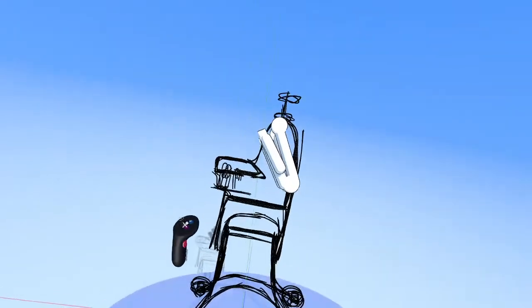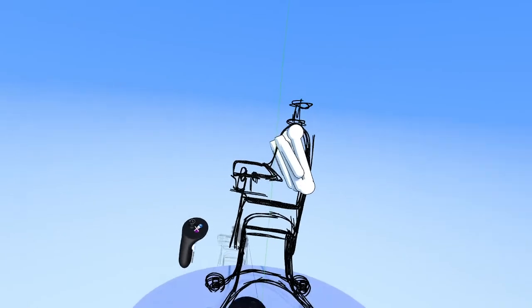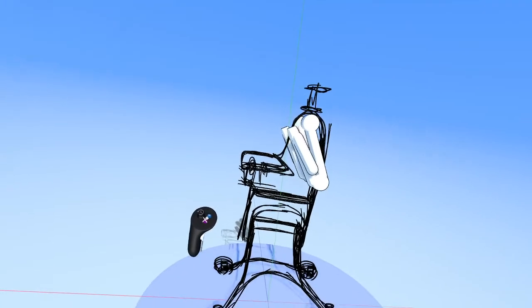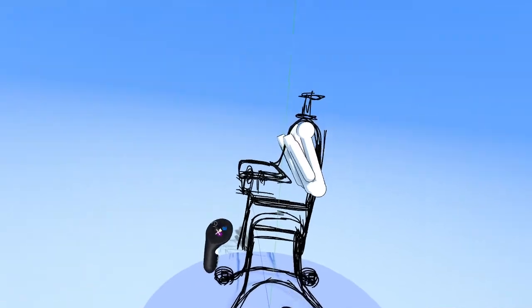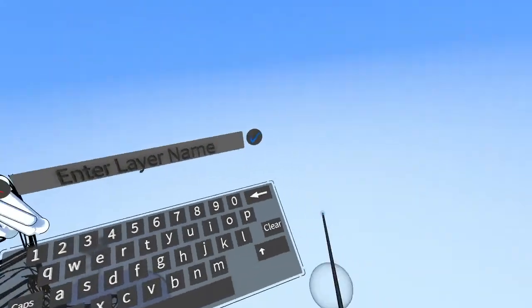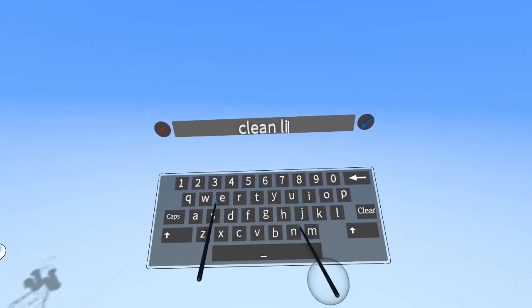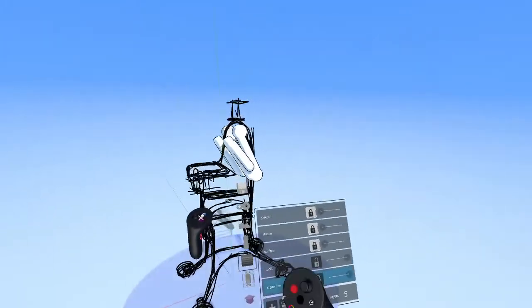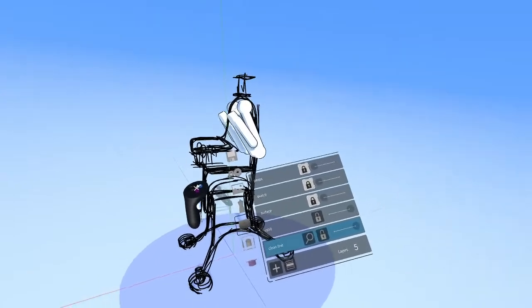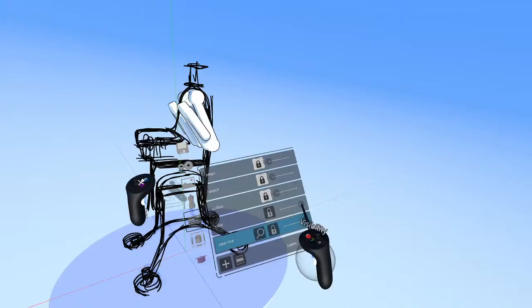Okay, so now that I have that, what I want to do is take this loose sketch and do a tight sketch over top of it so that I know exactly what the design is going to be, and I have something that will help me whenever I'm doing surfacing. So for that, let's create a new layer and let's call this clean line. All right, and keep in mind this is just one way of working. This is just the way that I like to build out projects, but there's really no right or wrong way in Gravity Sketch to get at the result that you're trying to get at.